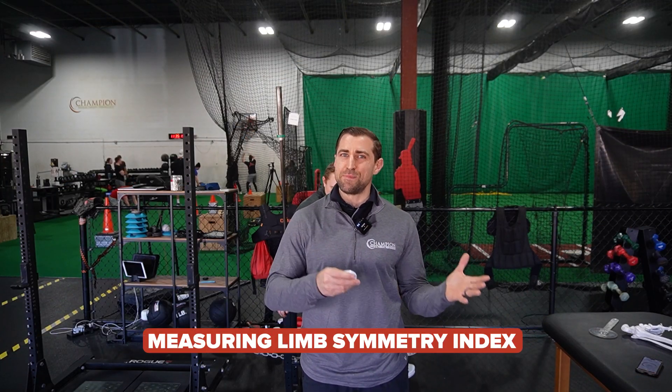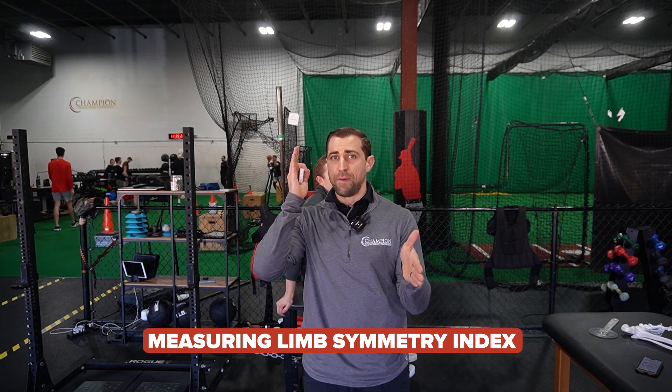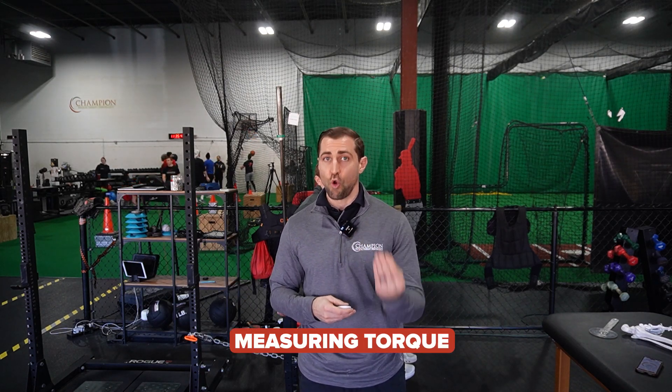We're looking for good limb symmetry index — essentially the involved side divided by the opposite side — getting as close to 100% as possible. The problem with LSI alone is that it doesn't measure how strong you are relative to your body weight. You might have great LSI but just be weak in general. So to ensure your athlete is strong enough, we want to measure torque.